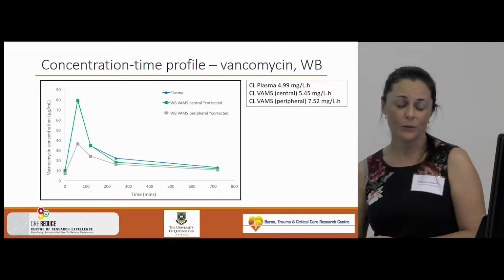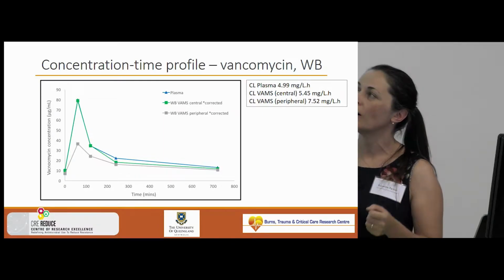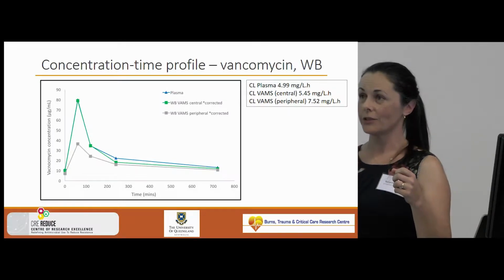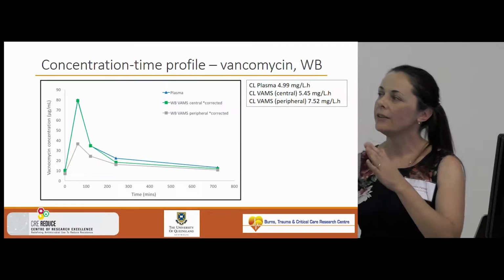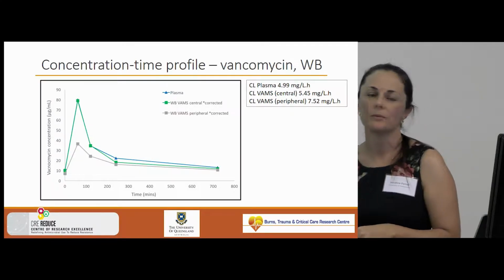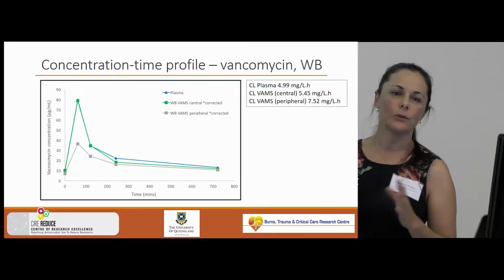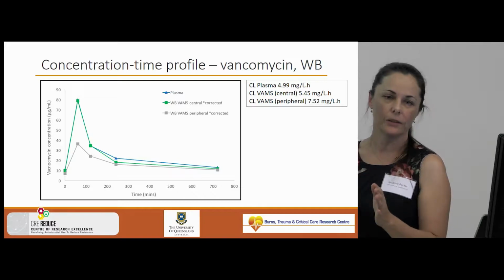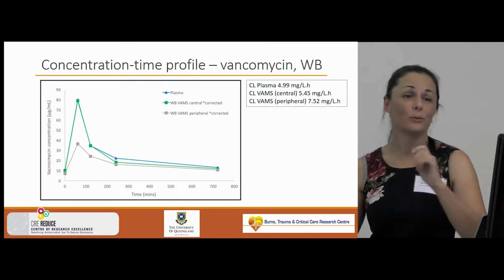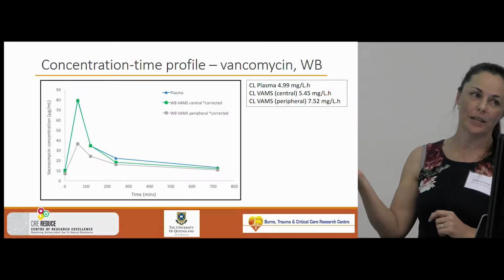We did do a simple regression where we check our plasma concentration to our whole blood concentration from the arterial line, and we get a slope of 1, which sounds great, and an R squared above 0.9 something or other. But we're very cautious in this sort of approach in analysing our data. I can get a slope of 1 quite comfortably with very variable data, so we prefer not to use this sort of method of analysis.